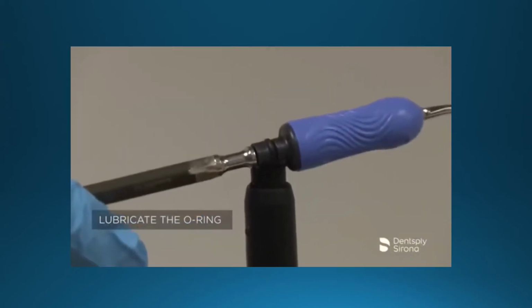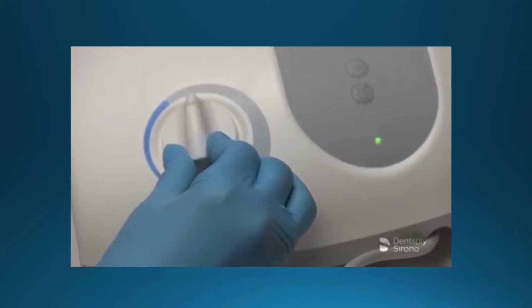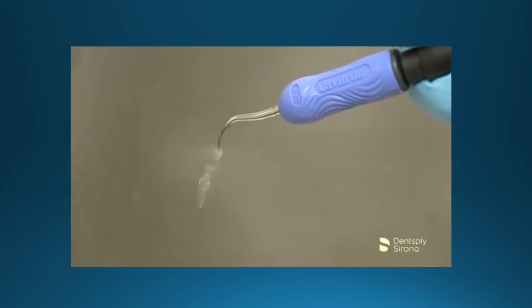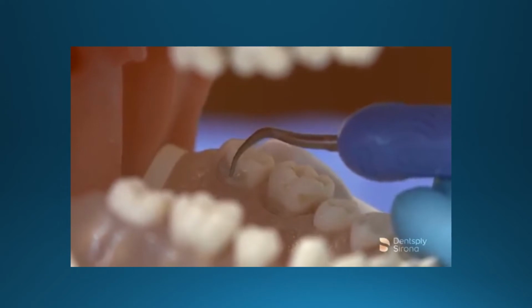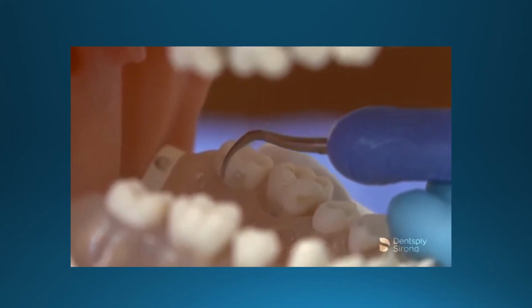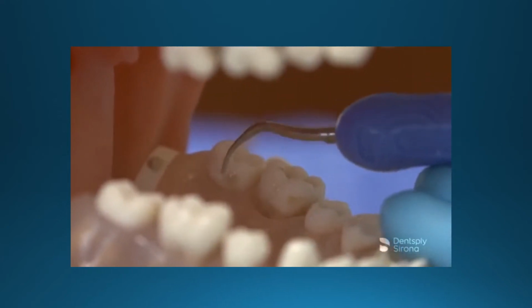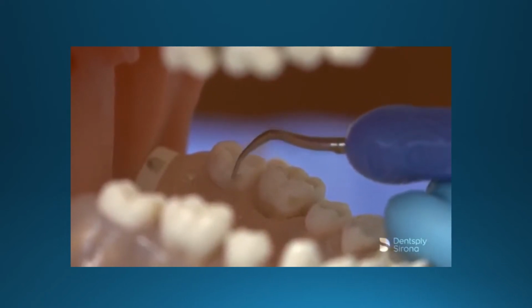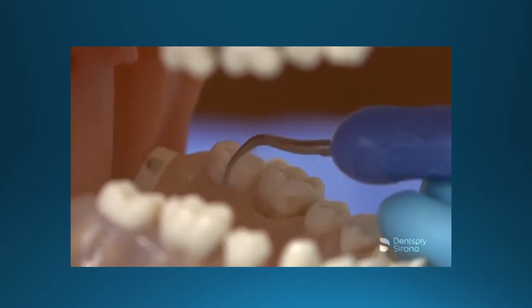After the clinician has filled the handpiece with water, seated the insert, selected the power, and adjusted the spray properly, instrumentation begins according to the treatment plan prescribed for the patient. The clinician utilizes the Cavitron FSI 1000 insert for deposit removal along the line angles and interproximal surfaces where heavier deposits are present. The clinician will start by adapting the lateral surface of the Cavitron FSI 1000 on the clinical crown and uses the back and/or face of the insert tip as needed.